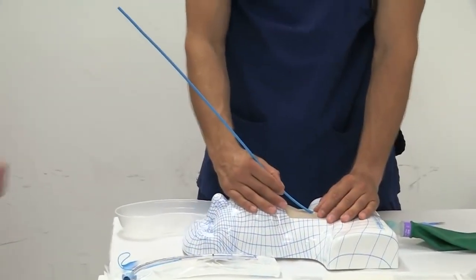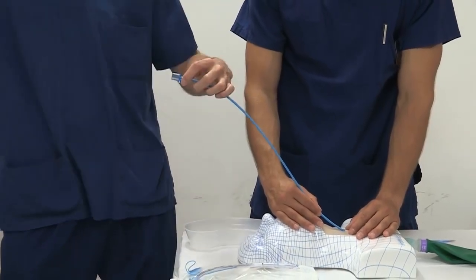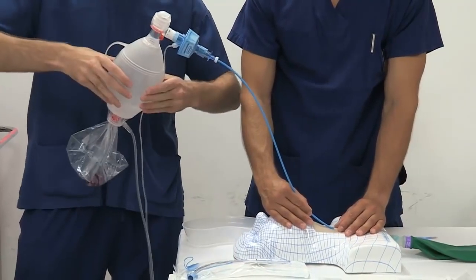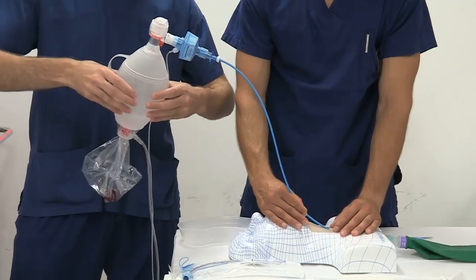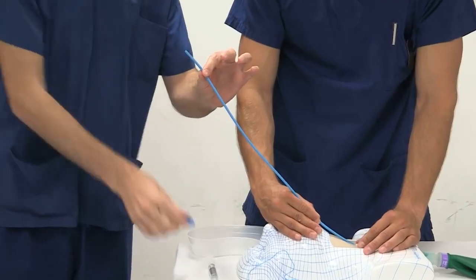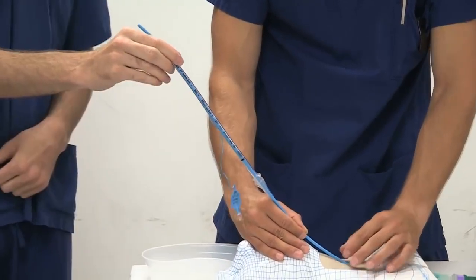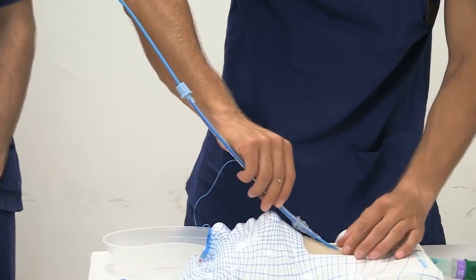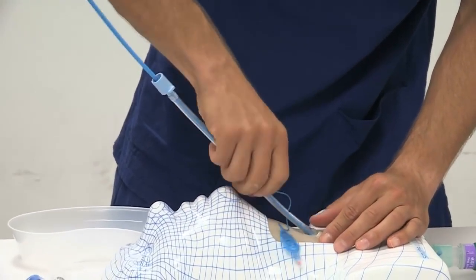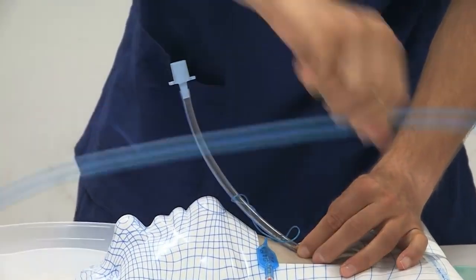A 15 mm RapidFit connector must be attached to the Scalpel Bougie to allow self-inflating bag oxygenation. This requires 2 operators, one to hold the bougie and one to bag. A size 6 endotracheal tube is then advanced over the bougie. While the non-dominant hand stabilizes the trachea, the dominant hand guides the tube using a continual 360-degree rotation technique to allow for smooth insertion of the tube into the airway. Note that we no longer recommend jetting down a bougie.